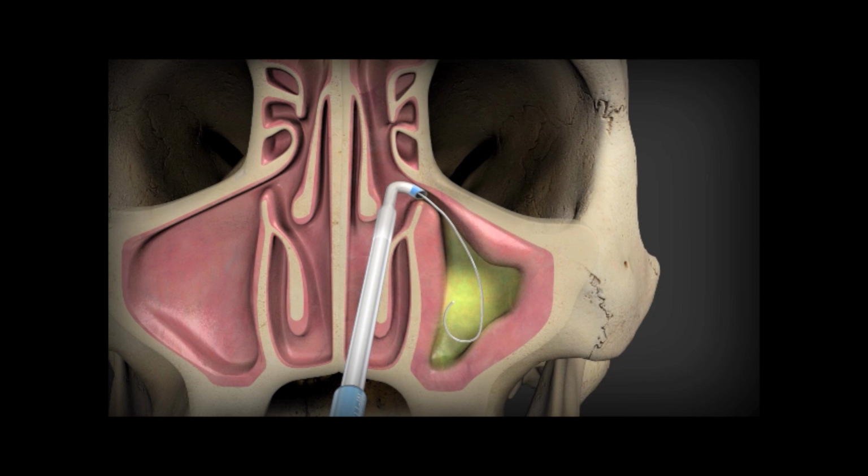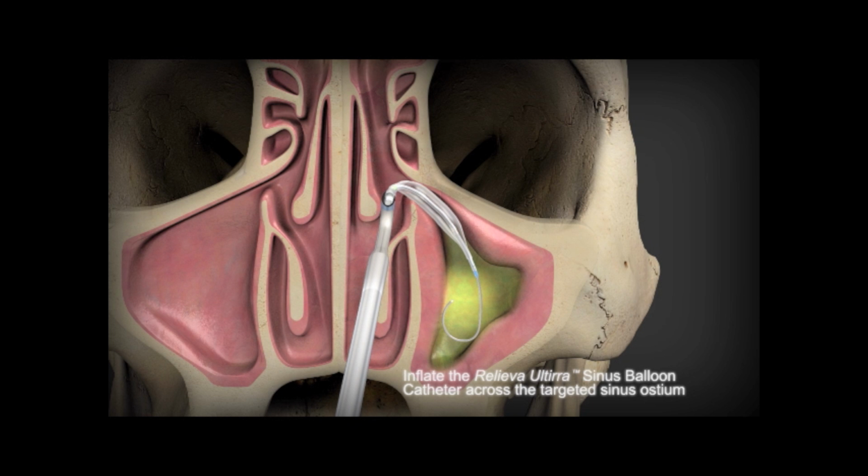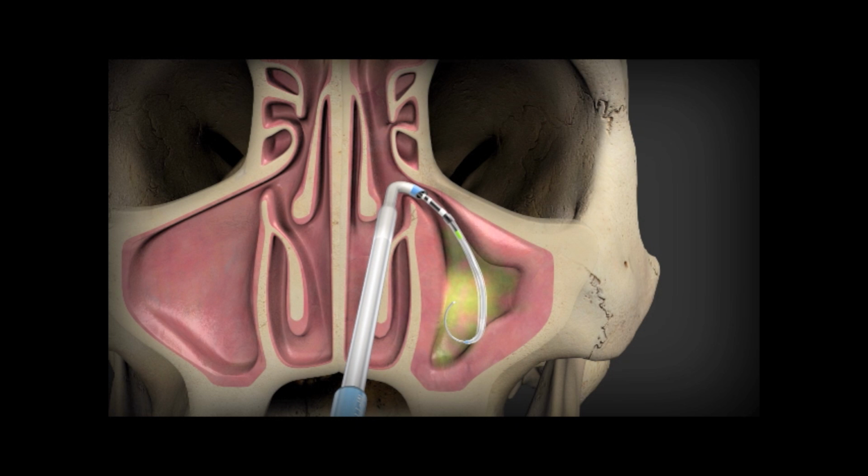And so you say, well, we're in there, no trouble, and then you feed that catheter over the top of it, and then these balloons are very, very strong, just like the ones for angioplasty, and they blow up to 10 to 12 atmospheres of pressure. They don't keep getting bigger, they just get real tense. And the idea there really is to remodel the bone a little bit.